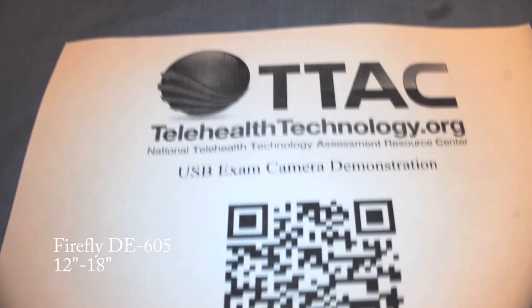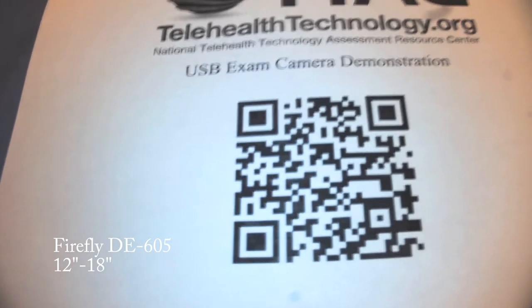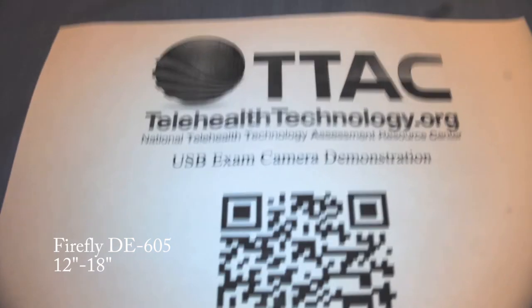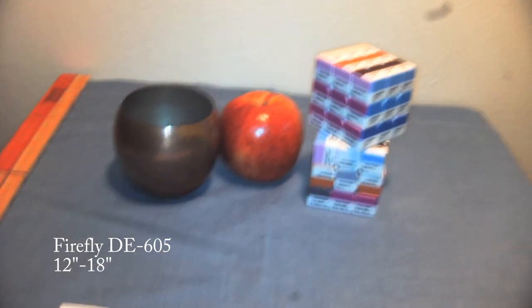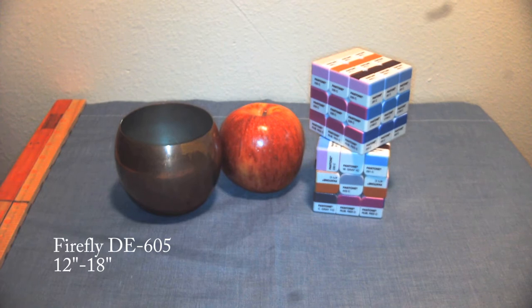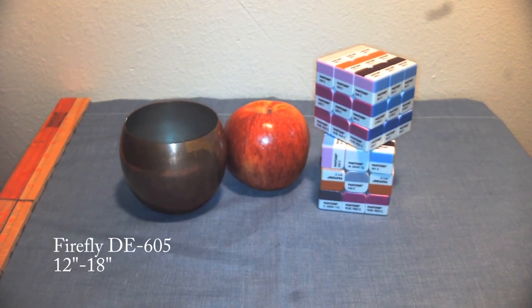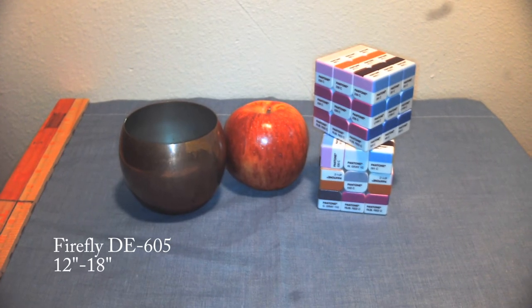In this demonstration, we will show the ability of the Firefly DE605 to capture images of test objects at a distance of about 12 to 18 inches from the camera lens. These sorts of views are useful for dermatology, neurological, and general exam purpose imaging.